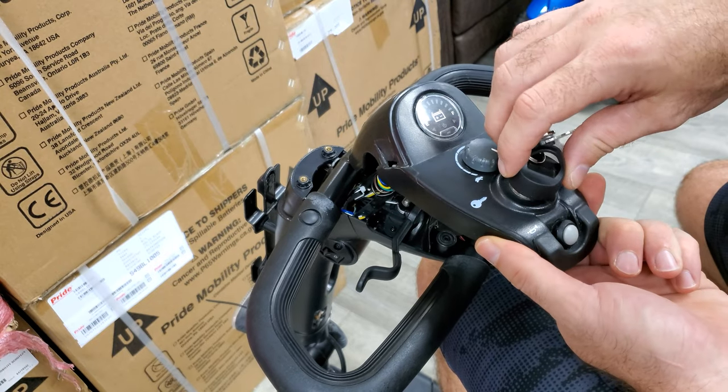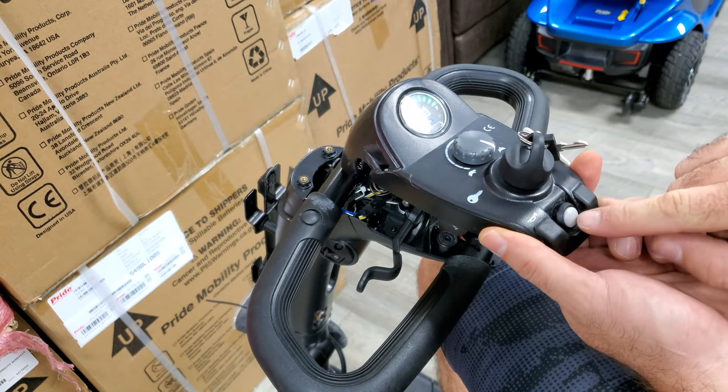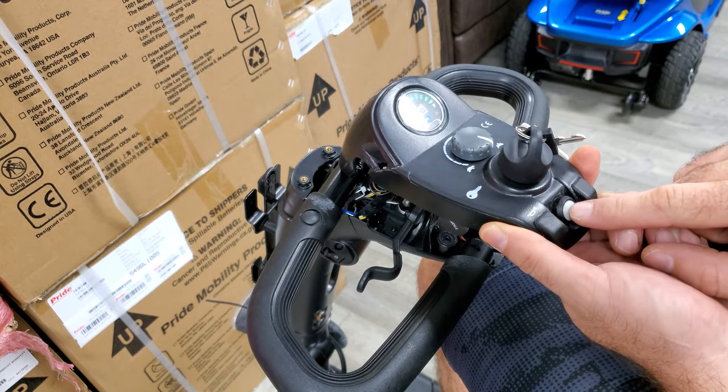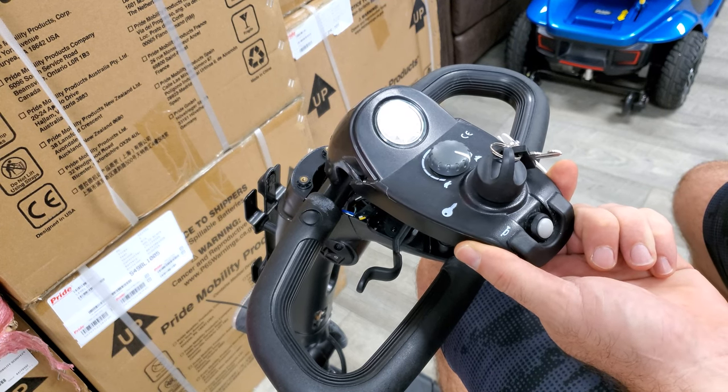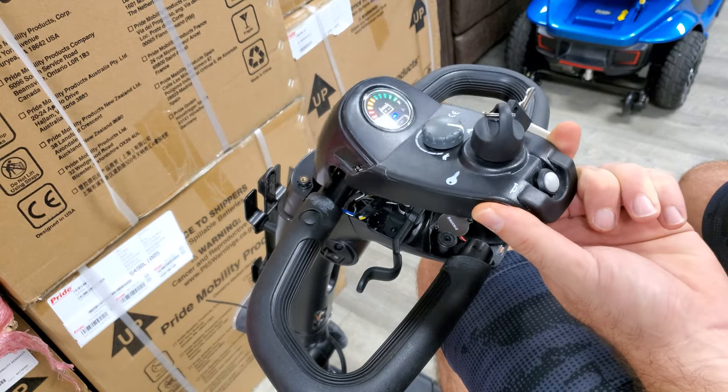We're going to go ahead and turn the horn on, put the scooter on, and press the horn. And that is how you replace the horn on your mobility scooter.